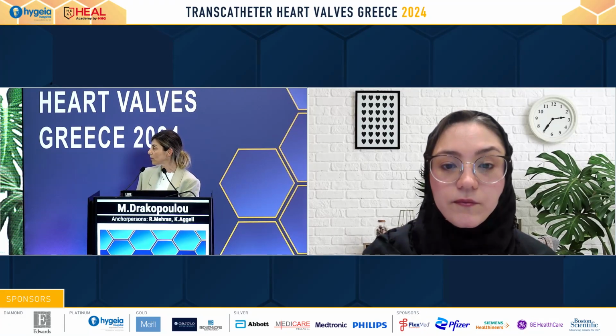Concerning ICE, we only do TOE in our cath lab with Professor Aggeli. We're in the first department of cardiology in Athens University. So we don't have a big experience with ICE, but I think that it's a promising technology. Maybe in the next years, if we put it in clinical practice, it can offer some advantages, because we don't have to intubate the patient.